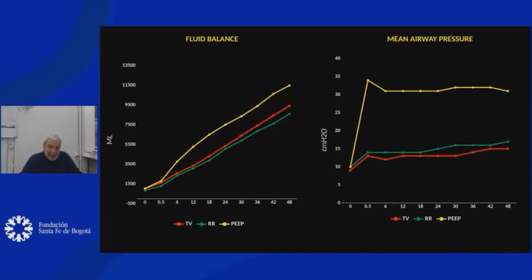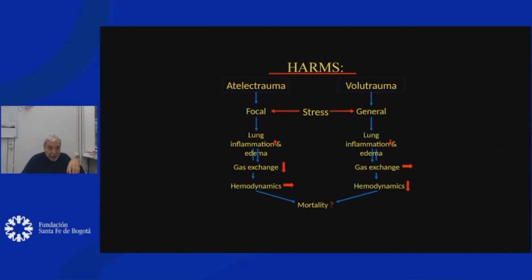You can see the fluid balance, here we had the isomechanical power, the same mechanical power, but provided by increasing tidal volume, frequency, or PEEP. When increasing PEEP, there is a tremendous difference in terms of water accumulation in the lung, but overall in the whole body.